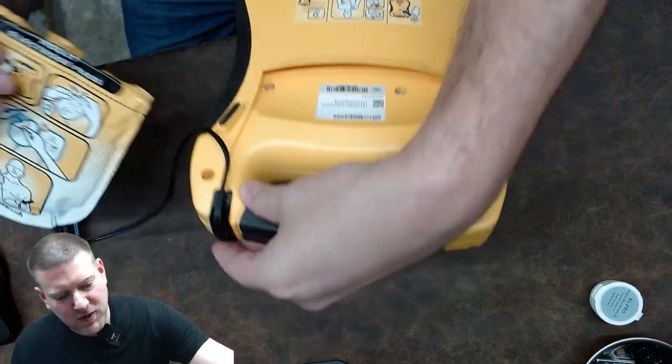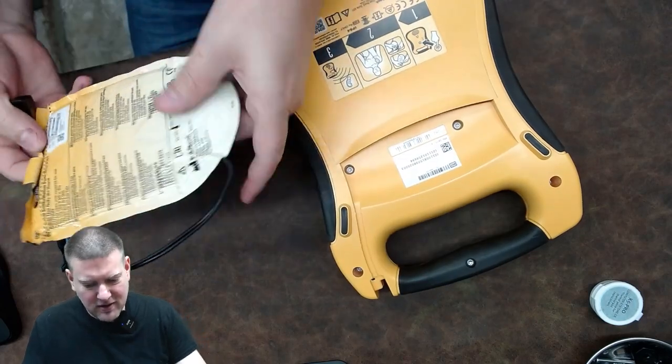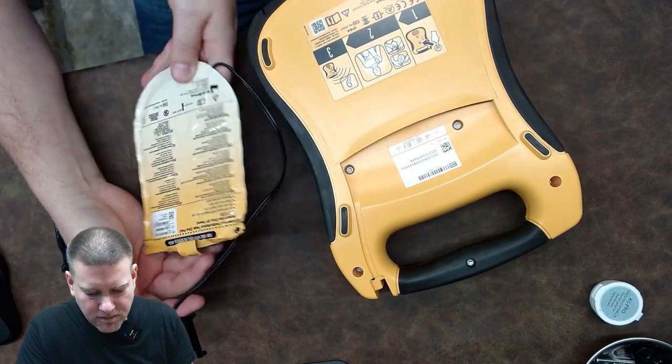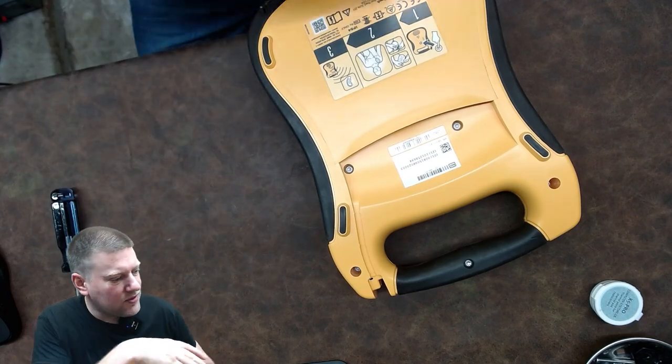First off, you can see I've got my pad pack, which connects at the handle — kind of interesting. I haven't seen one like that before. This is just a trainer set, so I'll go ahead and set it aside.